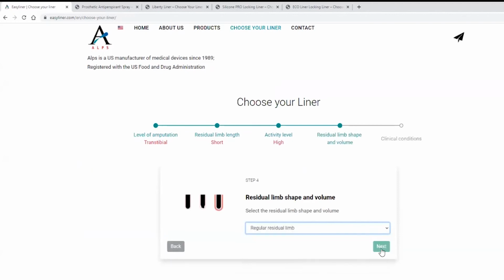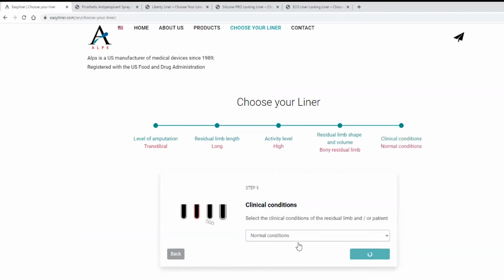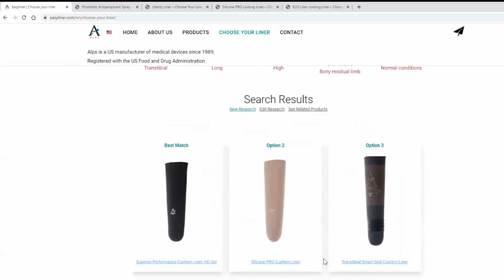We'll call it a regular shape. And it's pretty quick, this is an easy process. Then you can run each of your patients through this so they feel like they're part of the decision-making process, like they're really in charge of their health. We hope and want to see patient compliance go up as well because they feel like they're part of it now. They're not just buying the selection. I found that as a clinician, if you involve the patient in the decision-making process, the tendency is to be more compliant. So I agree with that. Make the decisions with the patients and you'll see better compliance for sure.